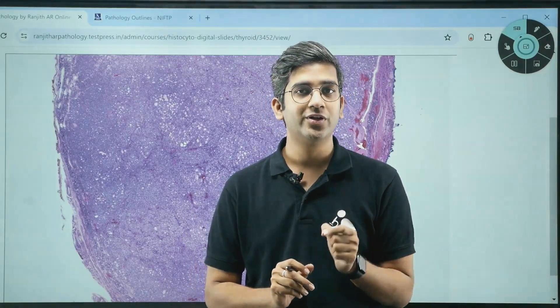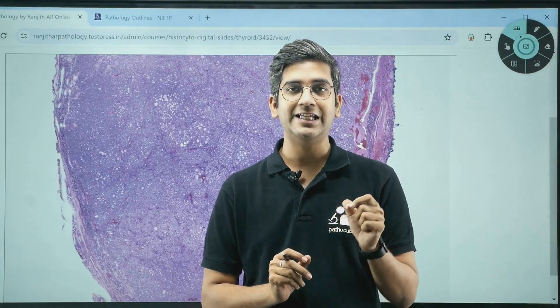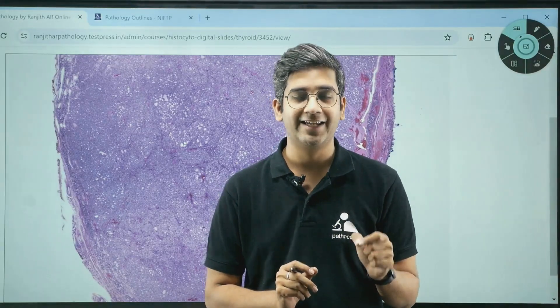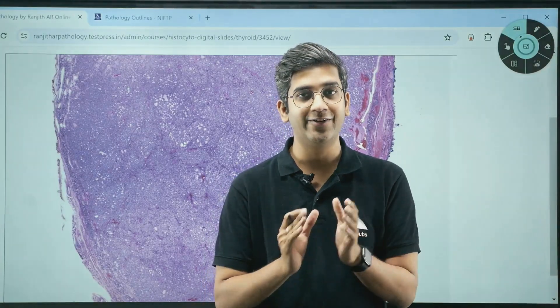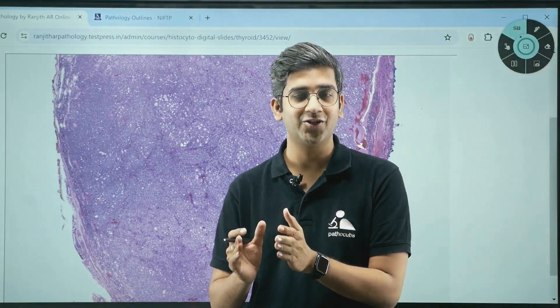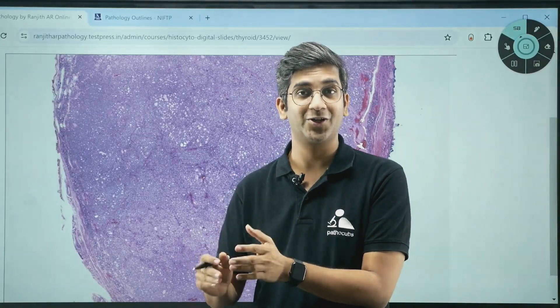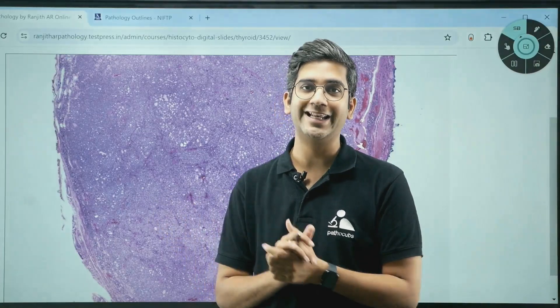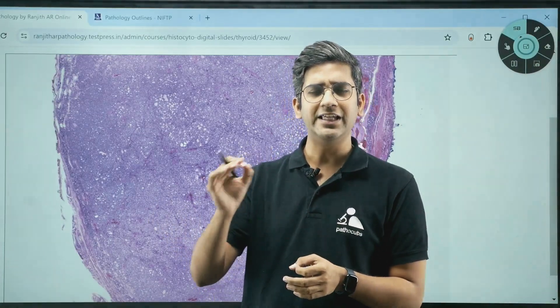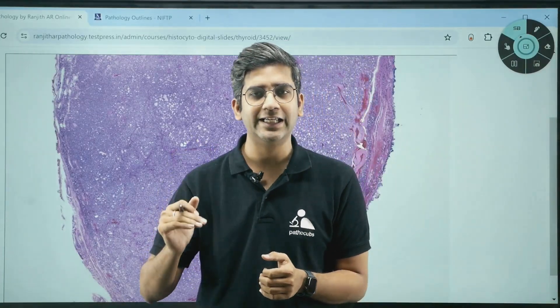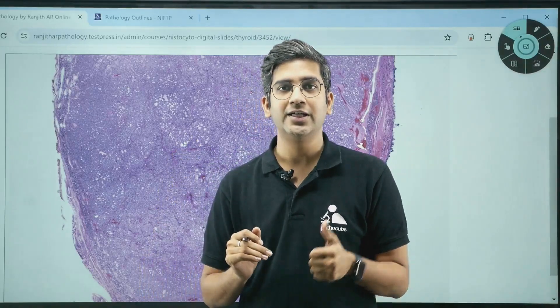Here we are going to discuss a very classical case of NIFTP — non-invasive follicular neoplasm of thyroid with papillary-like nuclear features. There are very unique criteria to diagnose that.